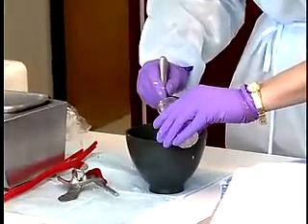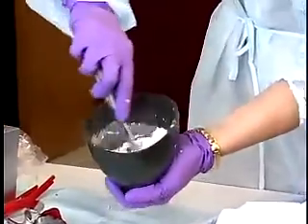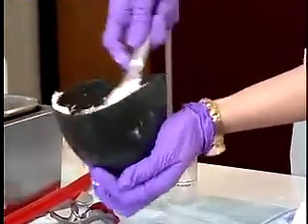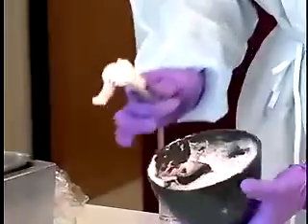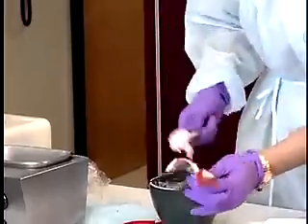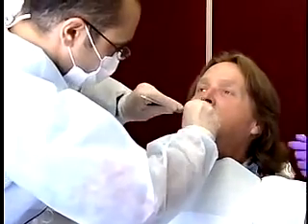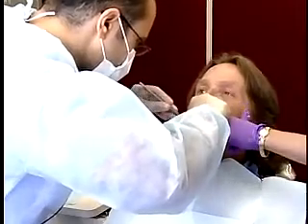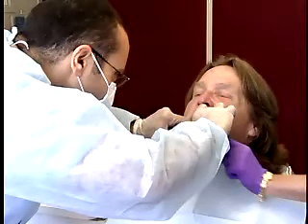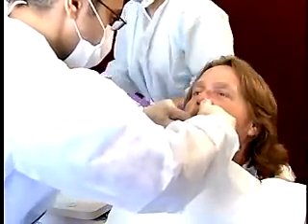The alginate is mixed following the manufacturer instruction. Then loaded into the stock tray. Stand in front of the patient and place the tray at the left corner of the mouth. The right corner of the mouth is reflected with a mouth mirror. Center the tray over the residual ridge so that the tray handle is in alignment with the median line of the face. At this time, the lip is pulled out so the alginate flows into the labial sulcus.